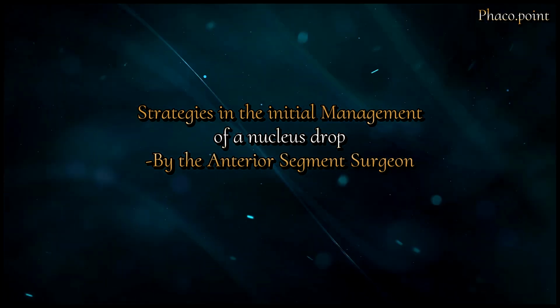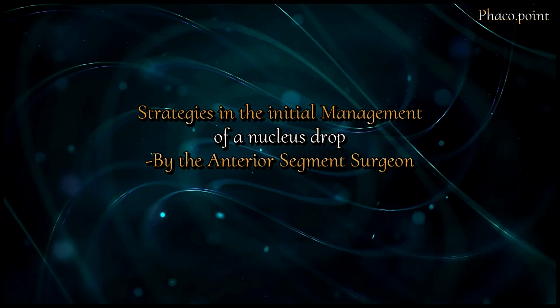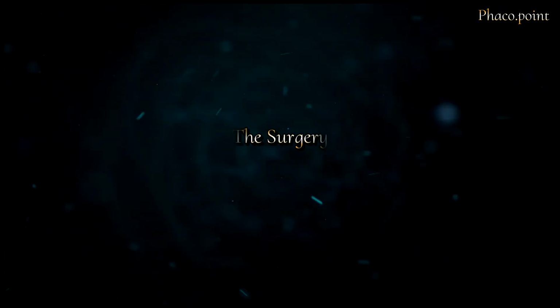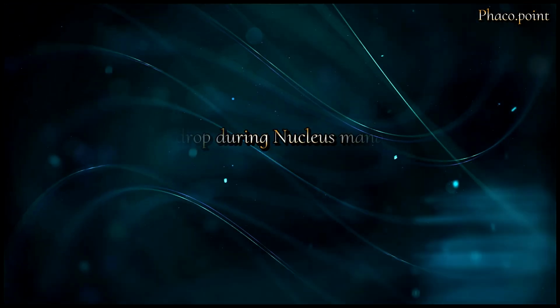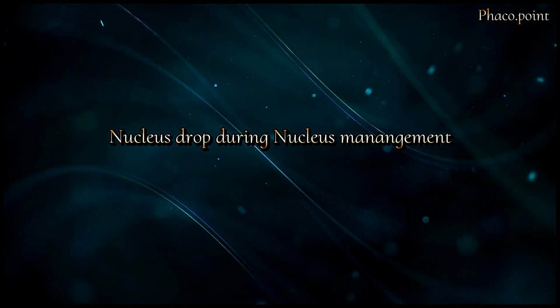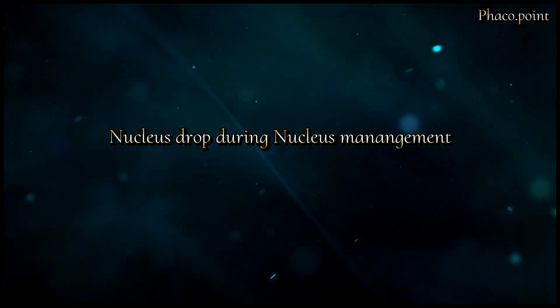I'd like to now discuss a systematic approach in how we should manage the case when we have a patient with a nucleus drop. Let's now move to watching the surgery. One of my students, while performing a phacoemulsification, ended up with a nucleus drop whilst performing the nucleus disassembly and emulsification. When I took over the case, this is what I saw.